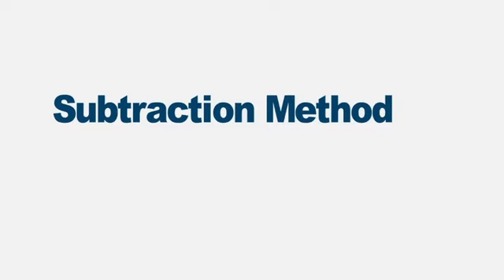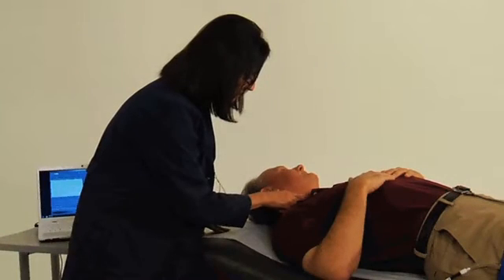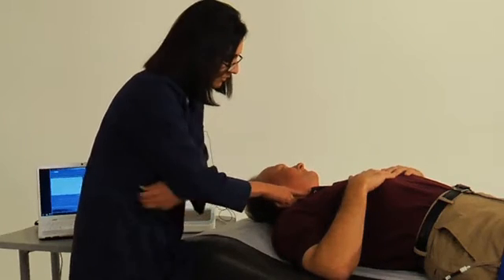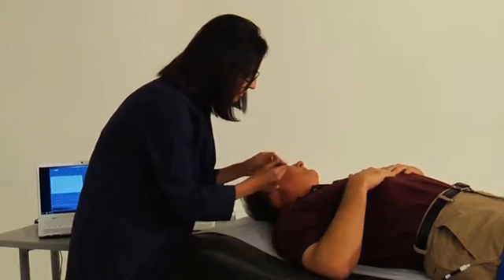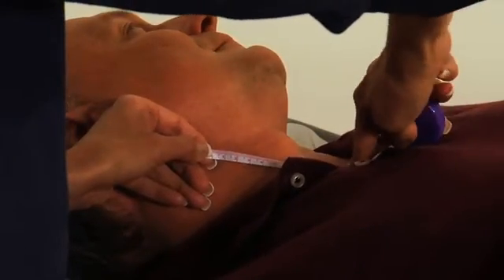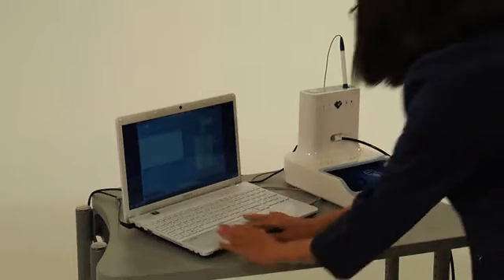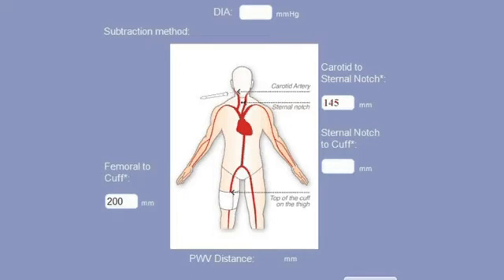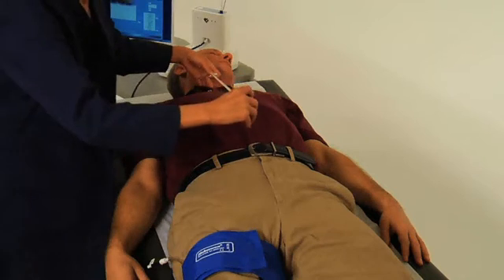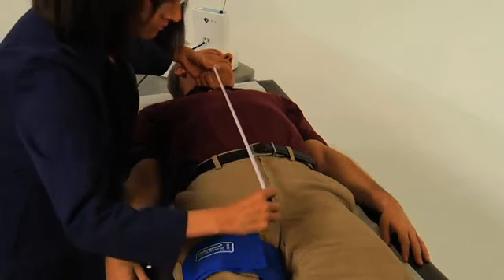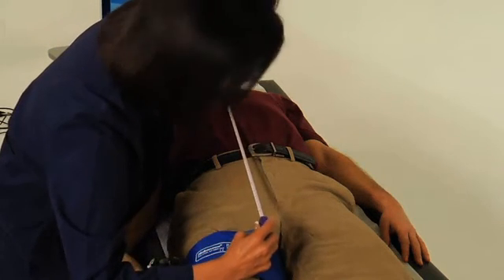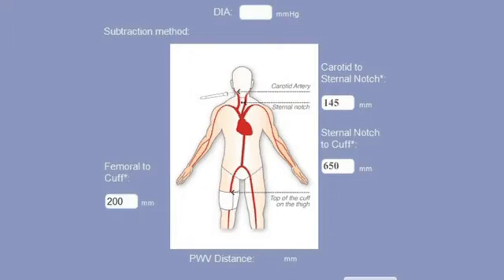If the subtraction method is selected, the distance must be measured from the point of the strongest carotid pulse to the sternal notch. Palpate the carotid artery to identify the strongest pulse point. Measure the distance in a straight line from this point to the sternal notch and enter the value in the box marked Carotid to Sternal Notch. Take a second measurement from the sternal notch to the top of the femoral cuff and enter the value in the box marked Sternal Notch to Cuff.